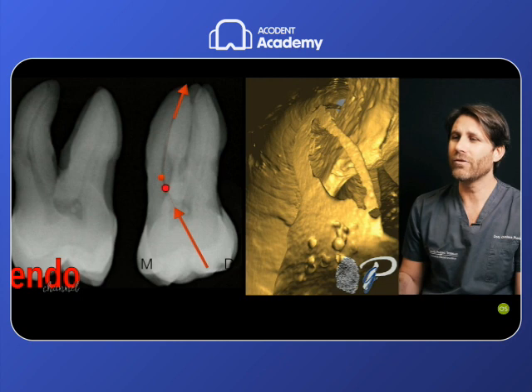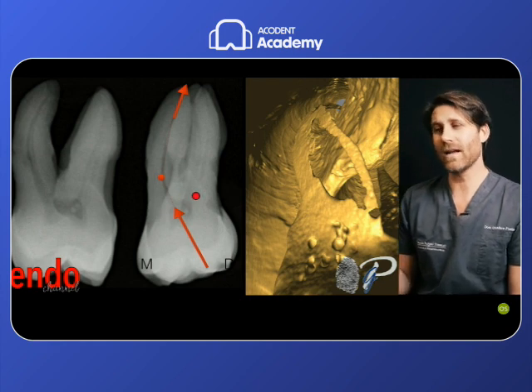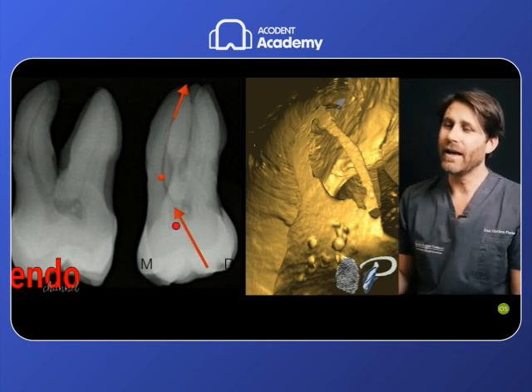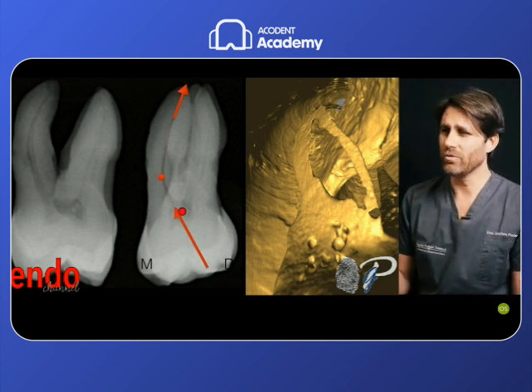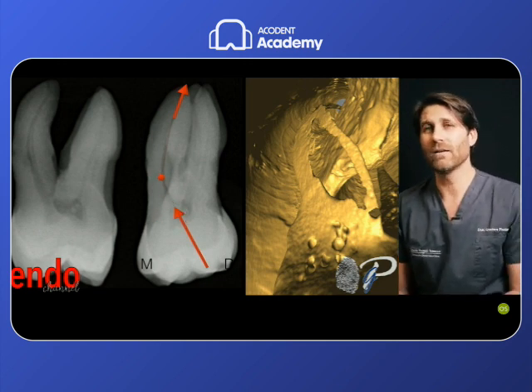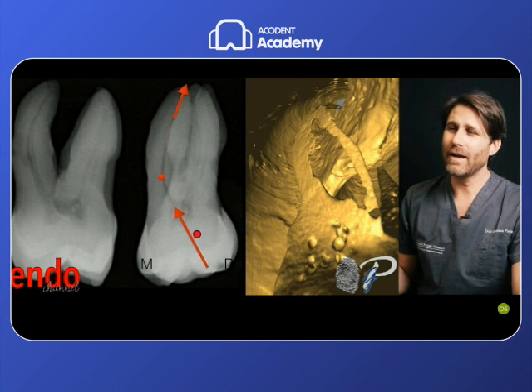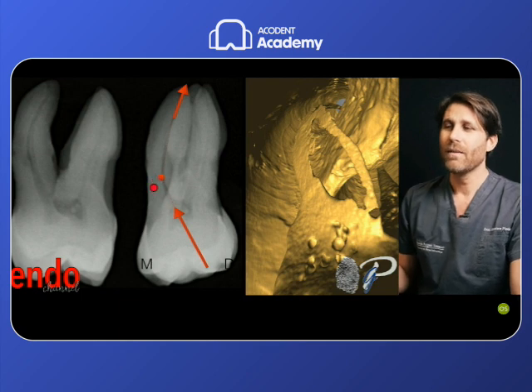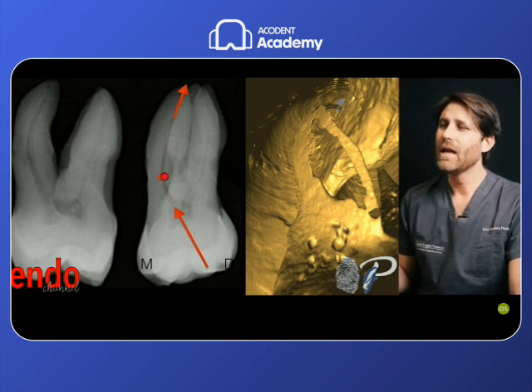So in this case, the problem of these root canals is that this amount of dentin that is covering the MB2 moves the orifice of the root canal towards the center of the pulp chamber, giving the direction of the entrance of this root canal a very inclined distal direction for this MB2 root canal. So in the first 2, 3, 4 millimeters of these MB2 root canals or similar root canals, we have a root canal that has this particular trajectory, this particular inclination from distal towards mesial, because of the presence of this part of dentin that is covering the orifice and moving the canals toward the center of the tooth.